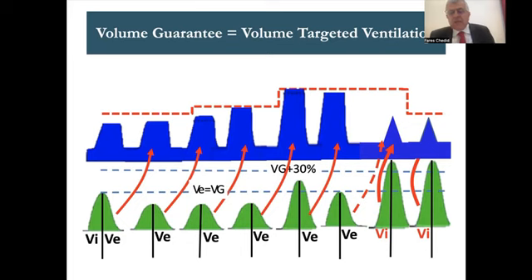Because during the inspiration, there might be leak. We know that the volume expired at least came from the lung. And if there is leak, because the machine compares the inspiratory and expiratory flow and measures the leak, the machine will do what's called leak compensation to compensate for that amount of leak, because if there is leak, the volume expired will be less. We don't want the machine to give more PIP because the volume is less. The machine will compensate, considering that there was some leak. So this is the principle of the volume guarantee. I hope it is understood.